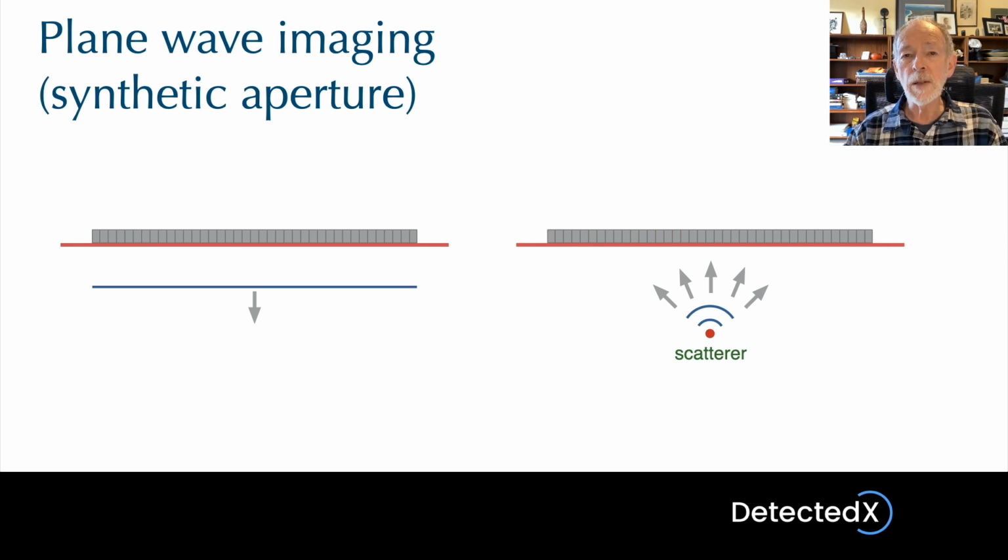It may well be that the future of ultrasound will become synthetic aperture imaging purely, but there are now machines producing extremely high imaging rates using an adaptation of this technique.